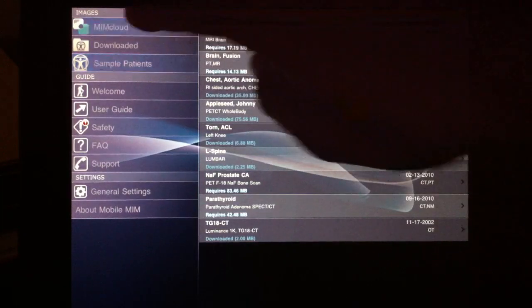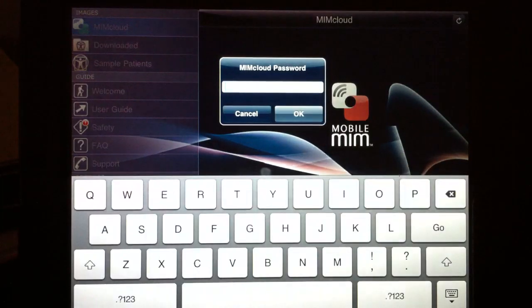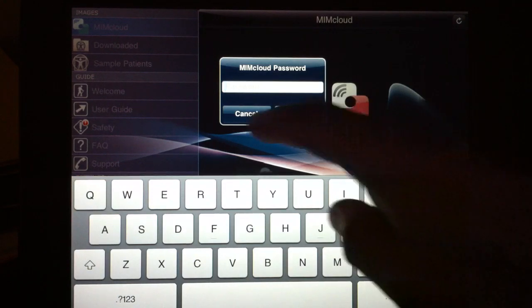If you click on the MIM cloud, it'll request your password. And this is how you get in and see the studies that you've uploaded to your cloud server.